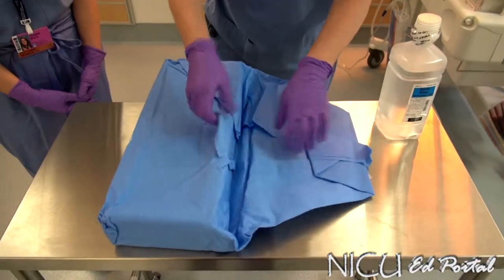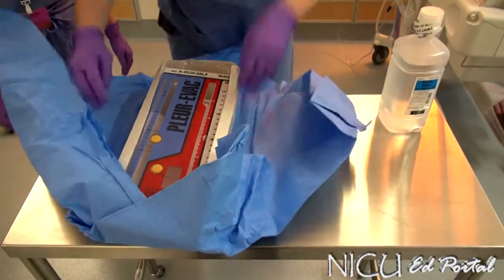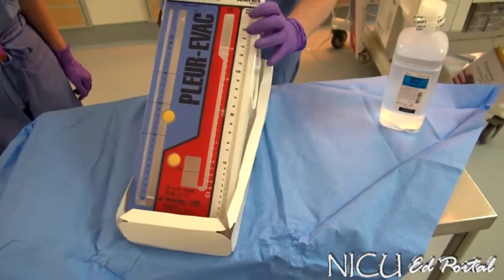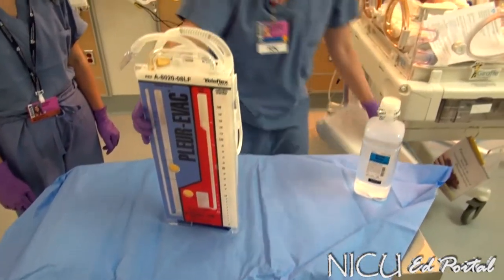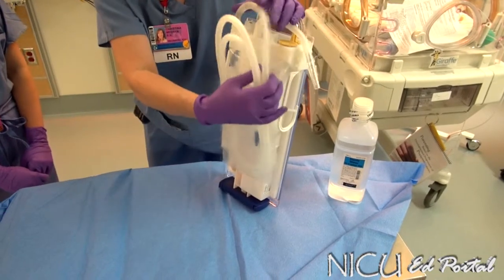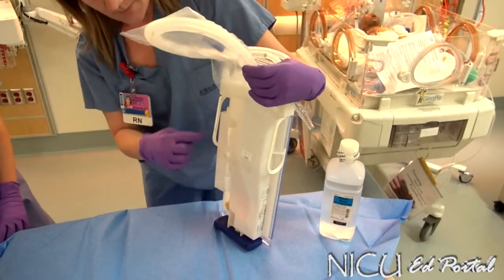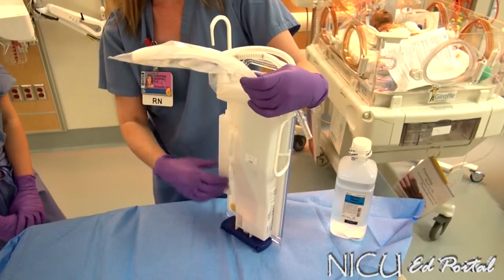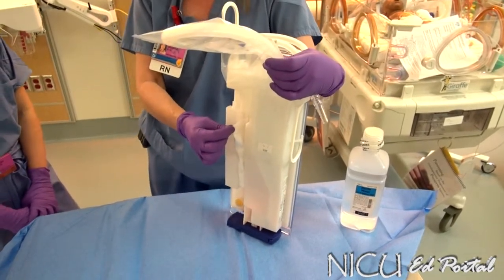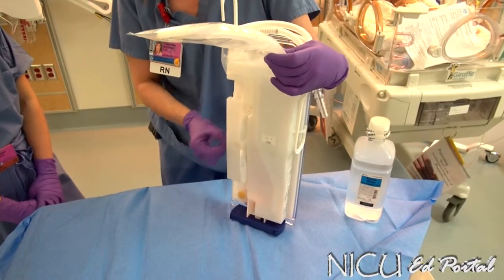I'm going to open this up and take the drainage system out. The back has some very important items that you want to make sure you don't throw out inadvertently. It has a funnel attached to it — that's what we're going to use to fill our water seal chamber. You also have an adapter here, so if you need an adapter when setting up a chest tube, that is also in the back.